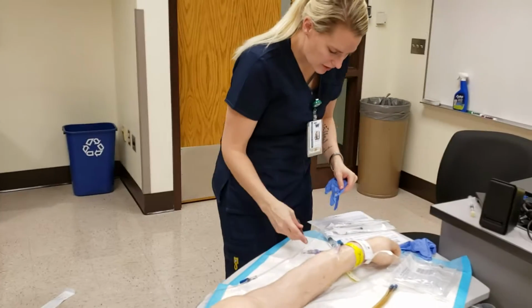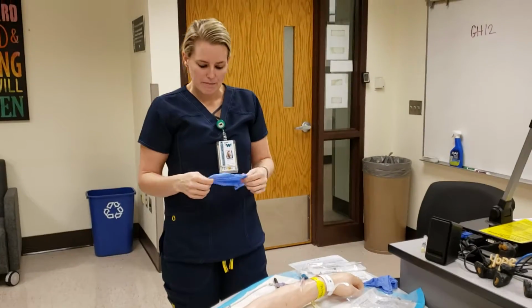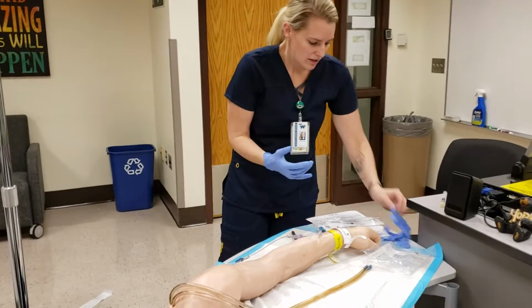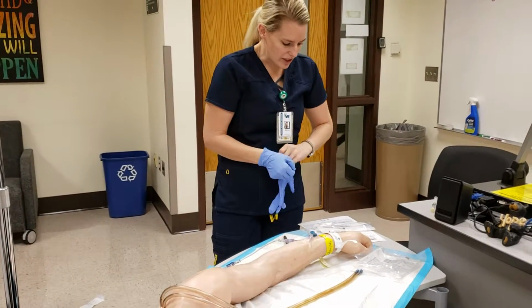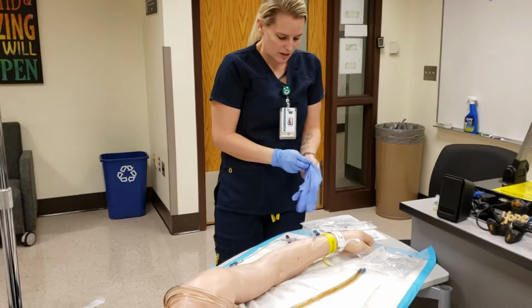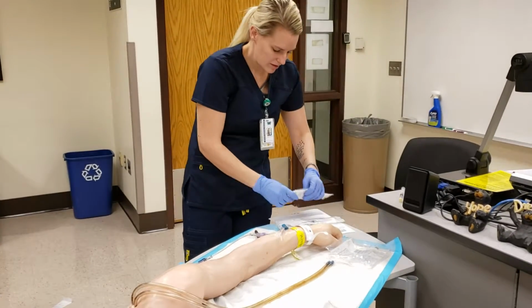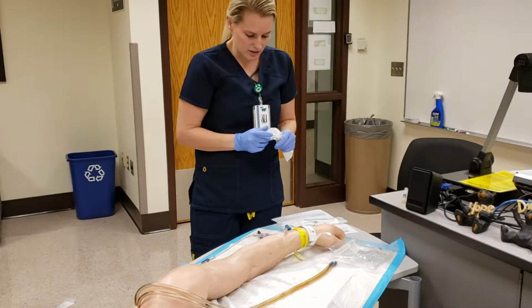All right, and then we're gonna go ahead and stop the pump, so we can give the morphine. So I've checked my medication to my MAR and done my pain assessment.